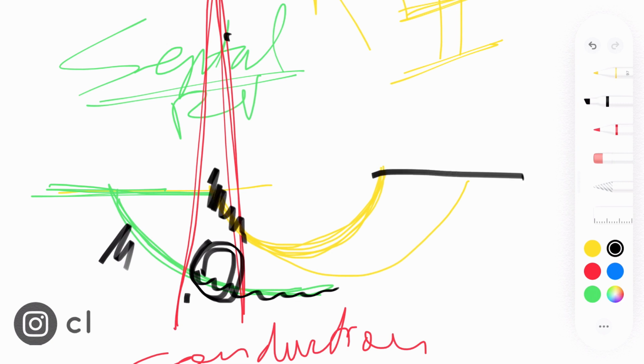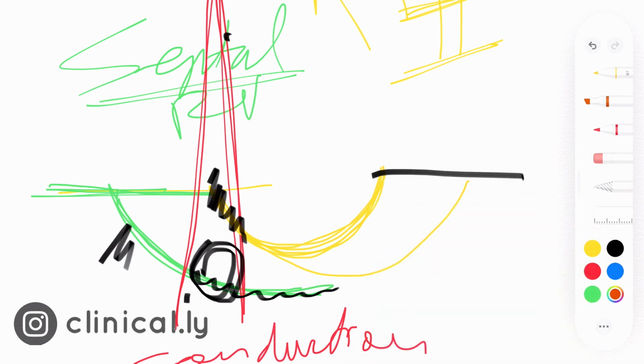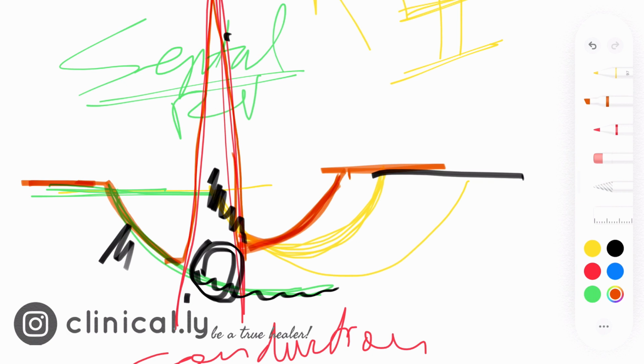So in summary, what remains is, let's take a different color. Okay, let's take this one. This was the isoelectric baseline, then this was the downward deformation, which was overtaken by the sharp upward wave, and then the second wave, and then the baseline.